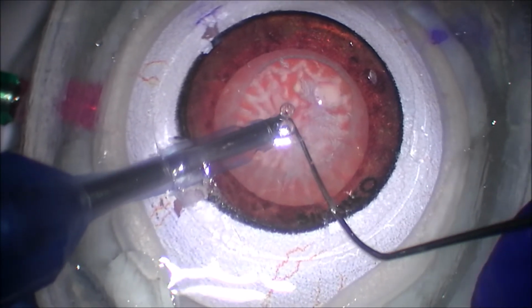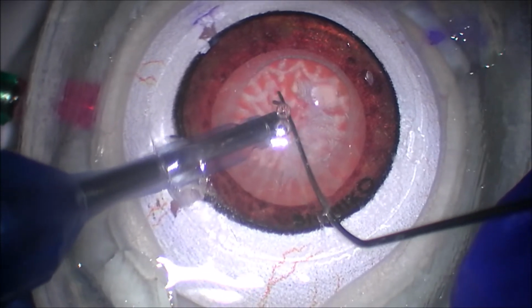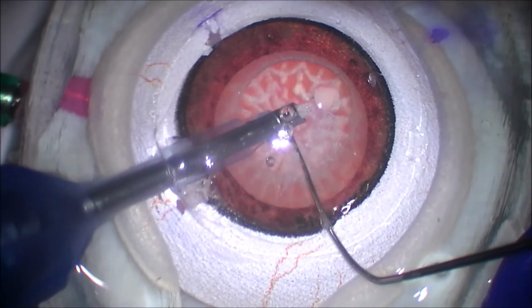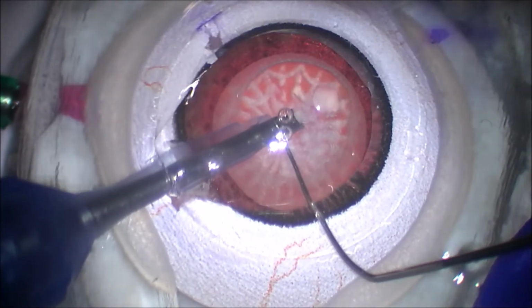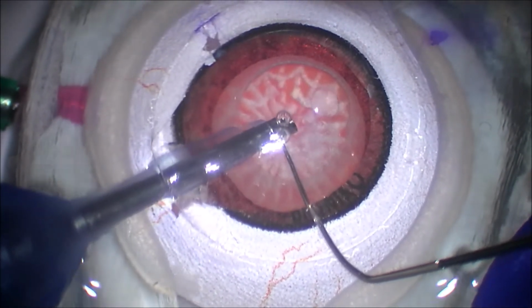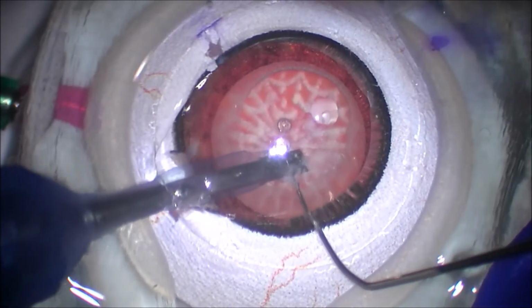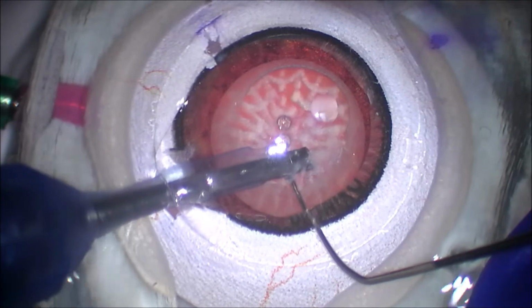But like I said, in general, as Bioniko would tell me, this is not tissue simulation, this is really maneuver simulation. So the lens itself, although it looks like a cataract, it's not quite the same as the true human cataract.